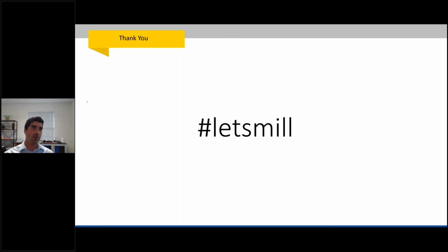So we've actually done something that no other software does. We've allowed, with the help of Zahn support, you to do a temporary access. We call it a temporary license. So if you've purchased the updates and it's just a matter of waiting, because sometimes it can take up to 2 weeks to fulfill that request, given all the factors involved, you don't need to wait 2 weeks.